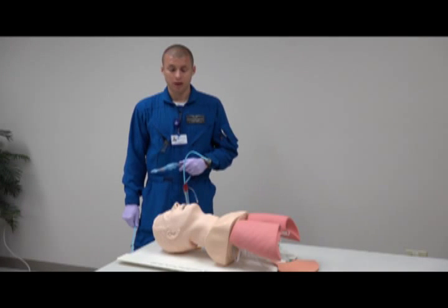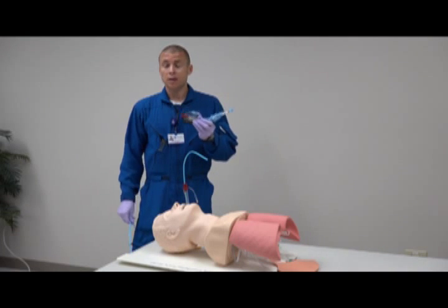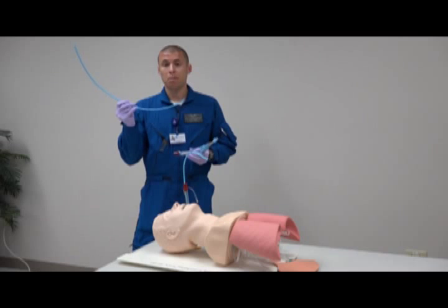Hi everyone, this is Nathan with St. Mary's Life Flight and I'm going to be going over how to exchange the King LTD using a gum bougie to an endotracheal tube.